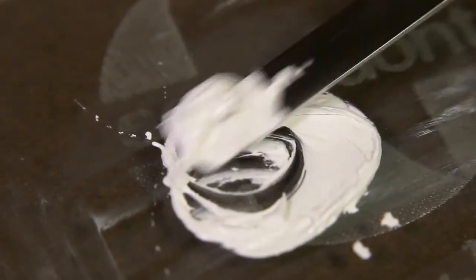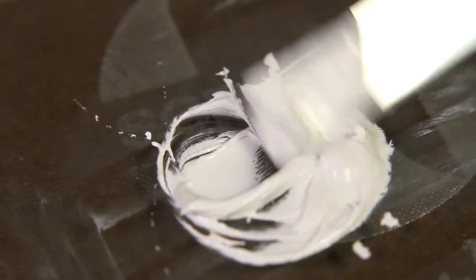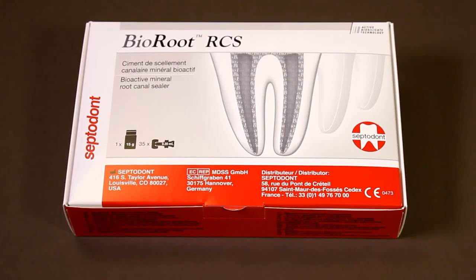Troubleshooting. Too much pressure on mixing could affect the consistency of Bioroot. If, for any reason, you need to remove Bioroot, this can be done using conventional removal techniques, as Bioroot is used in combination with gutta percha points.